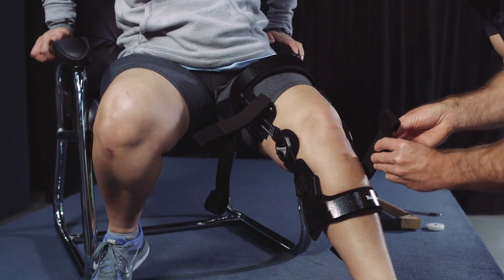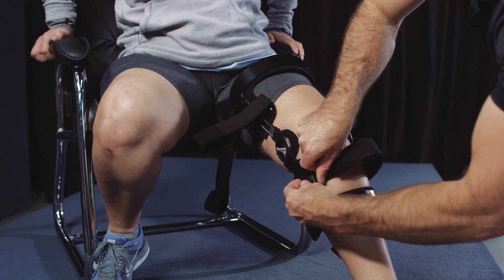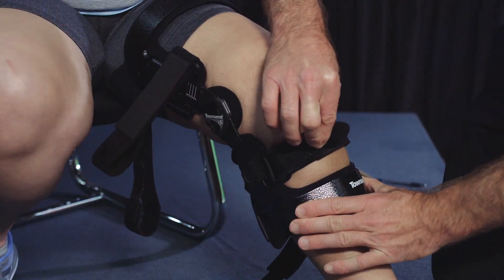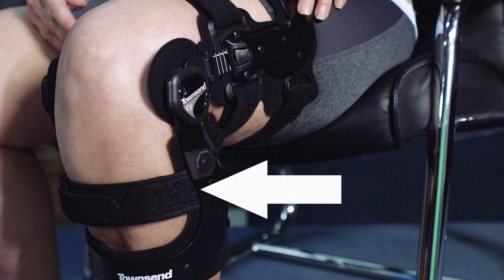Tighten the anterior tibia strap. The strap should be tight but not so tight that it pulls the hinges or the uprights too far anterior. If the hinges are properly aligned, the condylar pads should be located at midline on the sides of the knee or slightly posterior to midline. Remind the patient the strap should be left closed in the position you have set to ensure the brace is correctly positioned.